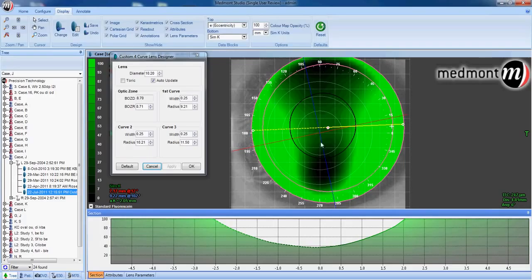With our bearing at 12 and 6 o'clock, the lens will not want to have a superior positioned lid attached type alignment with good movement with the blink, good tear pump. You would have movement along the horizontal meridian, possibly a positioning of the lens significantly nasal or temporal.